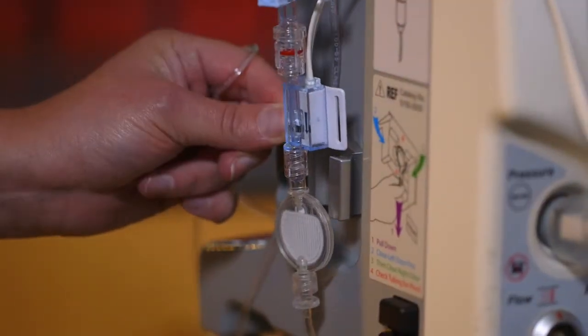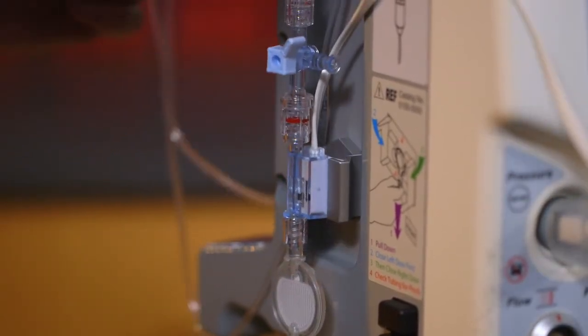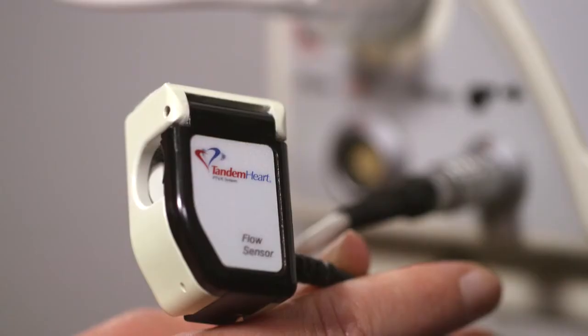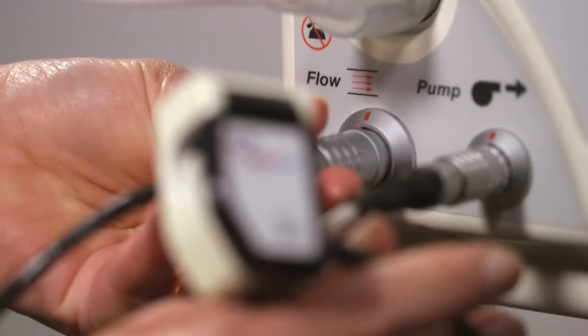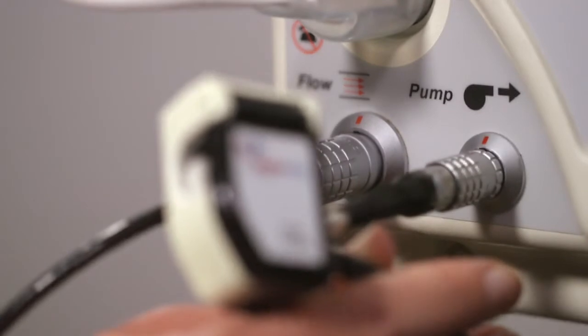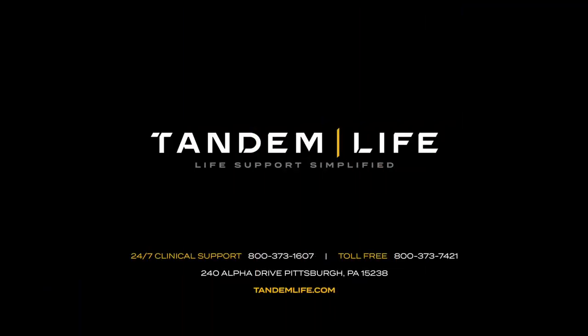The infusion lacing process is completed by placing the pressure transducer into the mounting bracket. The optional integrated flow sensor can be placed on the pump outflow tubing and plugged into the controller. For more information, contact your local TandemLife representative.